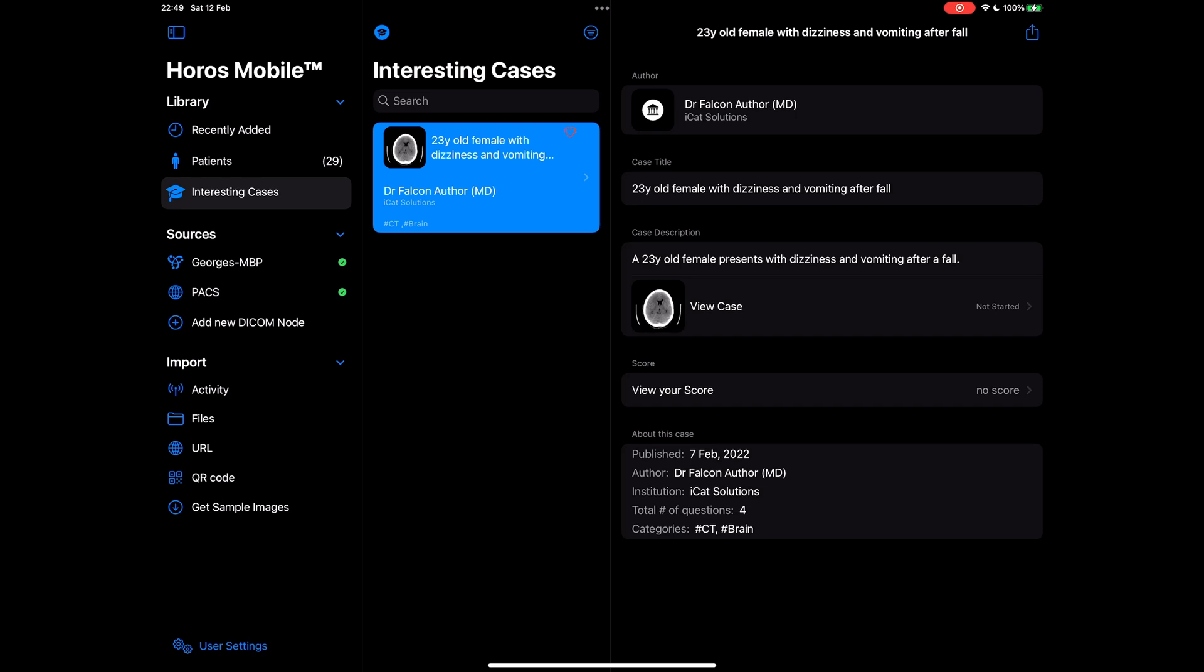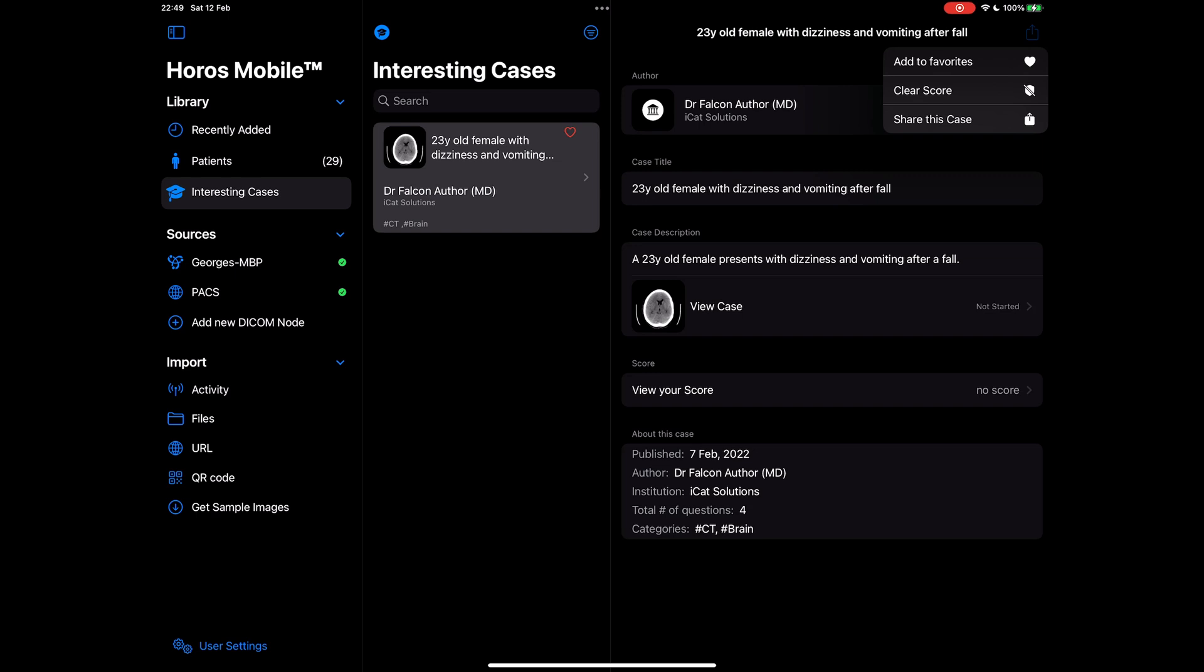In the details view, you can see the author, the case title and description along with the case thumbnail. You also see your score and your status: completed, partially completed, or not started. I can also add this case to my favorites, clear my score, or even share this case with anyone I want to share it with. Let's go ahead and start this case.